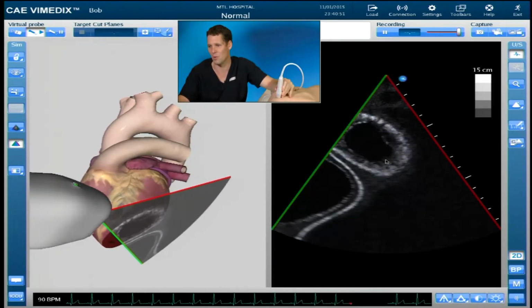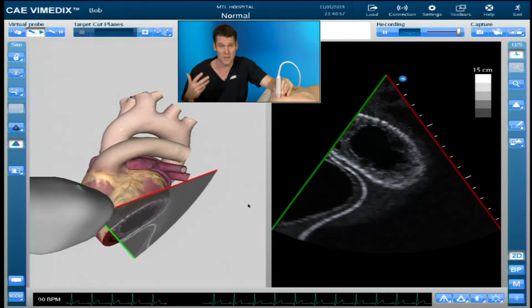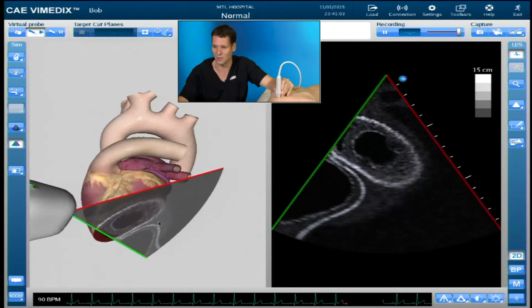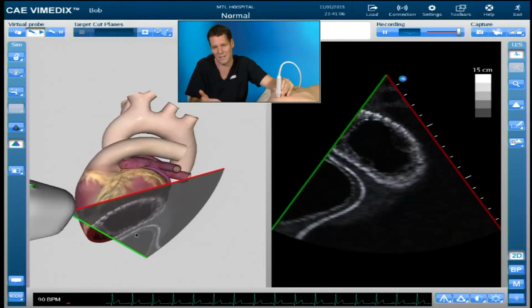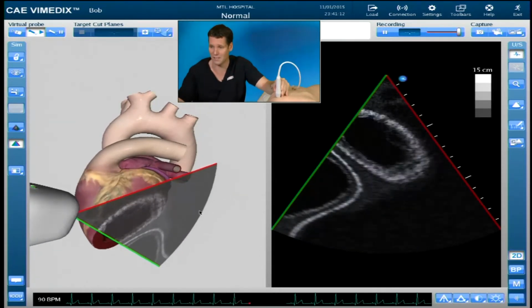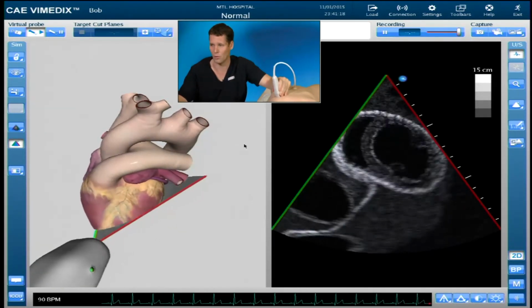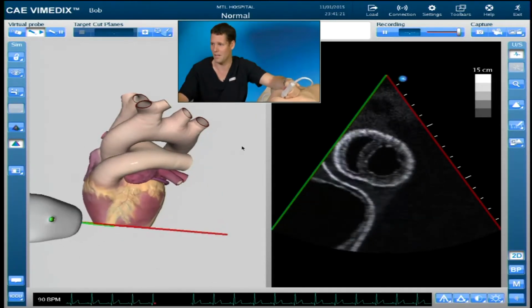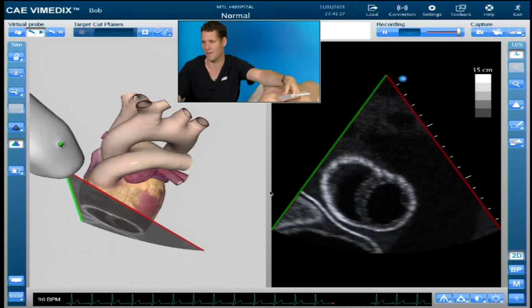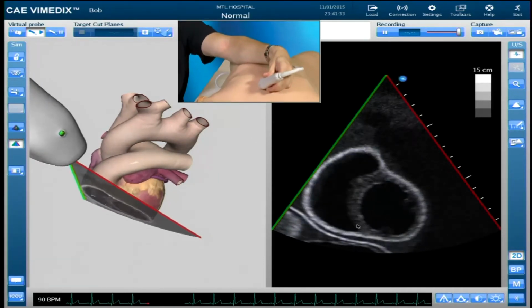If you're seeing something that looks more like an oval, that tells me that we're making one of two imaging mistakes. If you were going to bisect it perfectly at a perpendicular level, you'll get that circle. You can get this oval because you are rotated around it, so if you rotate it at a bad angle, you can get this oval. Or if you are imaging it obliquely, you can get more of an oval shape rather than the beautiful circle that we want.